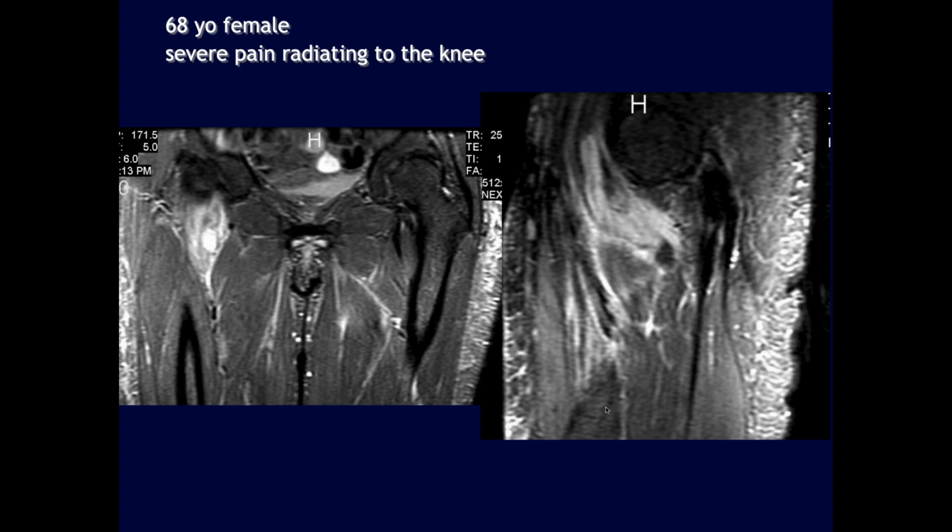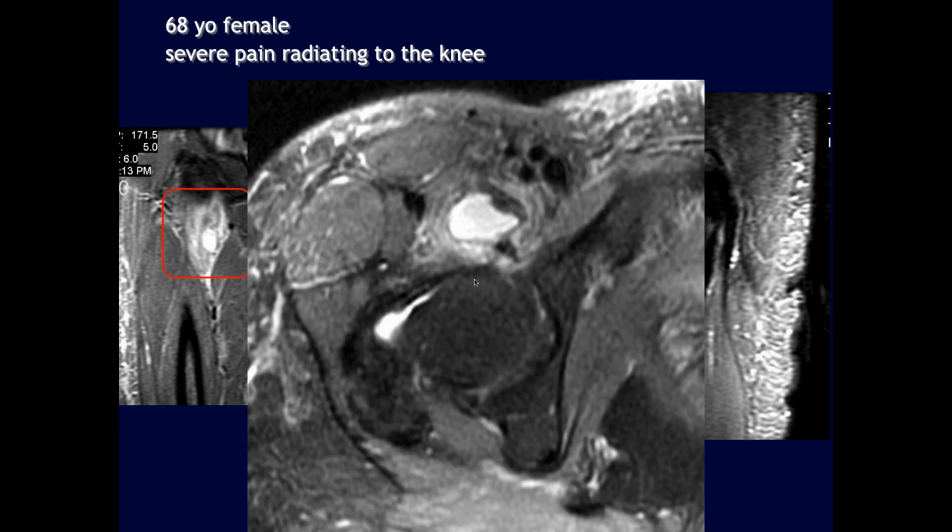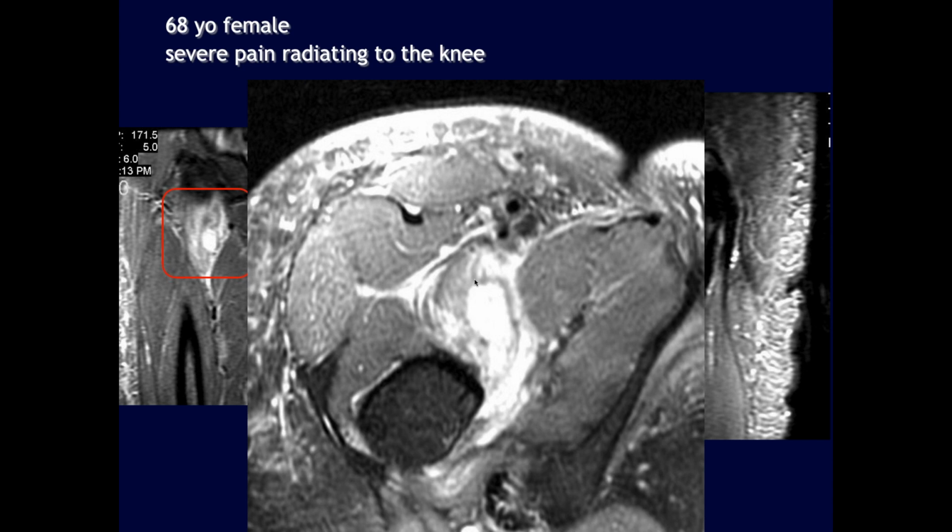68-year-old female with severe pain radiating to the knee. Again, it looks like we're in the region of the iliopsoas, and there's at least some partial tearing. Here I can't see any intact fibers, so I'm leaning towards grade 3, but I'd evaluate further. Here it looks like there may be some intact fibers, so probably at least a high-grade partial thickness tear or a high-grade grade 2 injury. And there's some surrounding hemorrhage and intramuscular edema.